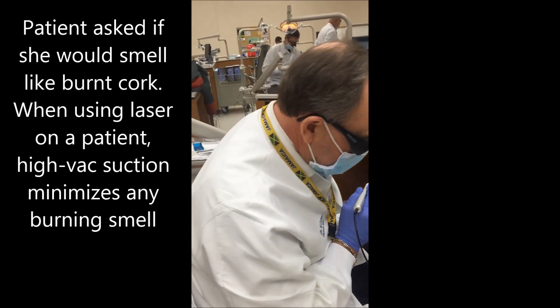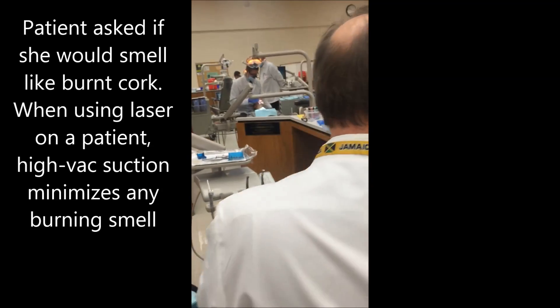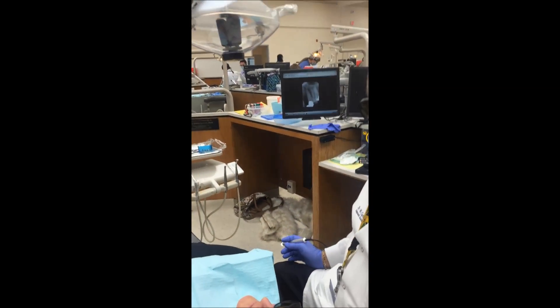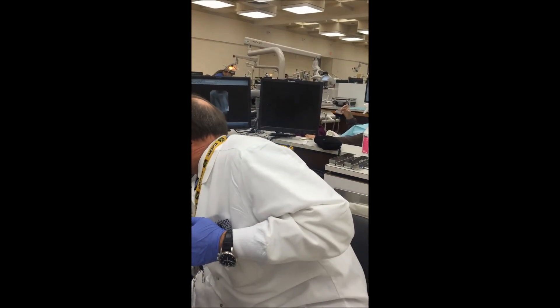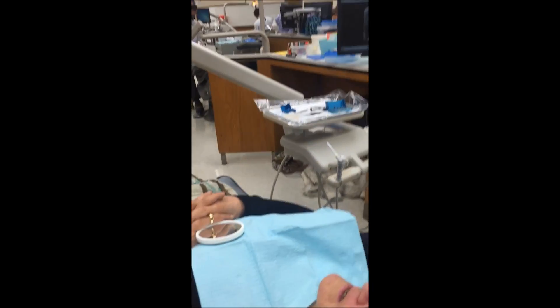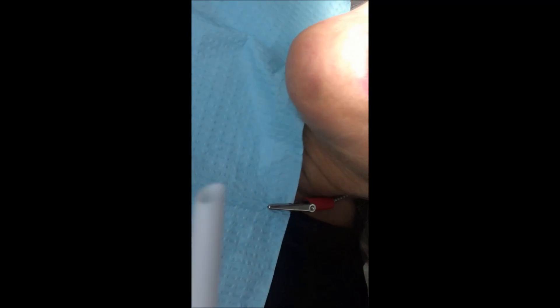Someone asks if they're going to smell like burnt cork. No, because someone is going to be back-suctioning. You definitely want to have suction going with this plume — or laser plume as they call it.